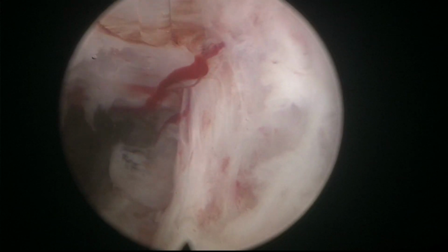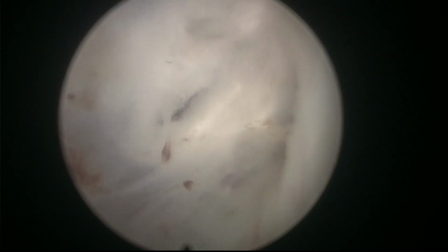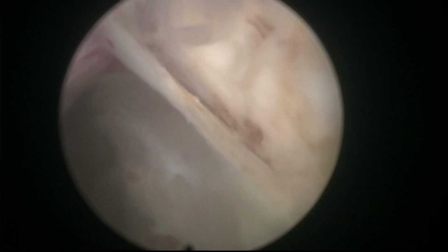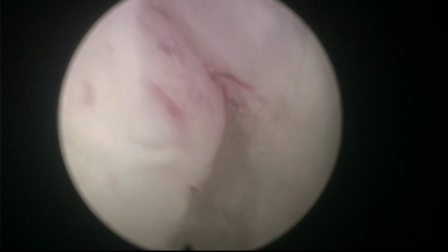So I like to dissect with energy after having done a lot of mechanical dissection to do GreenLEP over the years. I probably did thousands of cases of green light enucleation. Probably, I don't know, 3,000 cases, 5,000, 4,000 cases. And I found that it was interesting because it seems when you have a high volume of patients and a lot of operations in a certain period, you develop the sensitivity to do it better. And if I was on holiday, for example, when I returned from the holiday, I could feel that I was a little bit more clumsy, it was more difficult to keep the same proficiency at careful mechanical dissection.